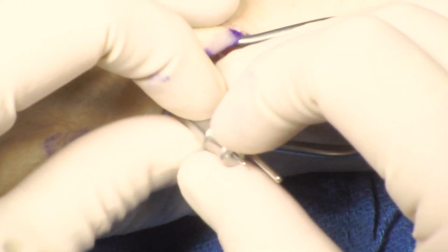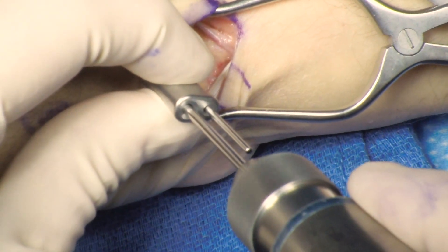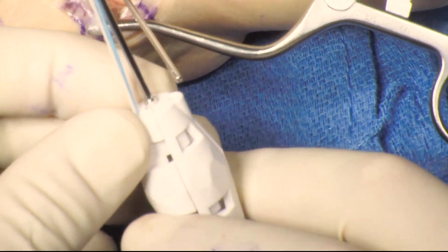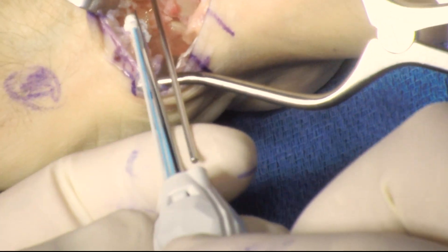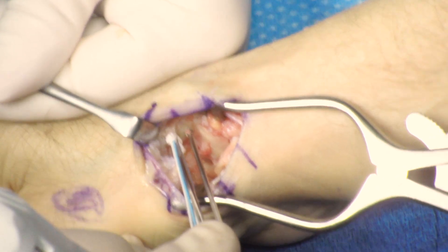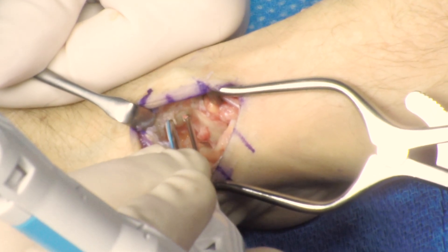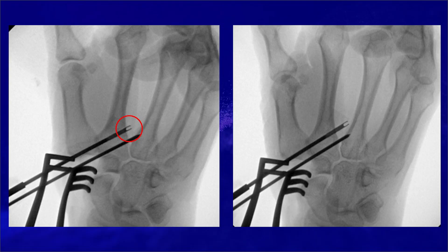The guide sleeve is then removed. A cannulated drill is then used to drill both the proximal and distal cortex, and it is cycled a few times to remove any debris. The Gripplasty T-handle is then used to insert the anchor. It's important to insert the anchor that has an eye on it for the index metacarpal. There is a hole in the inserter for the guide wire. The anchor is inserted — make sure that it follows the same trajectory as the prior K wire. Gently mallet the anchor through the tunnel, and it's important not to pass-point too far. Fluoroscopy is used to confirm the inserter is 7 millimeters past the cortex to allow for appropriate anchor deployment.